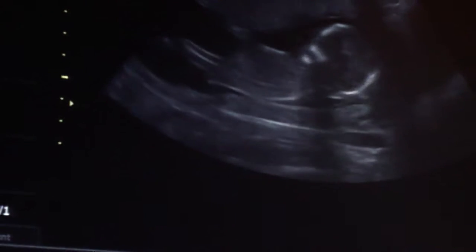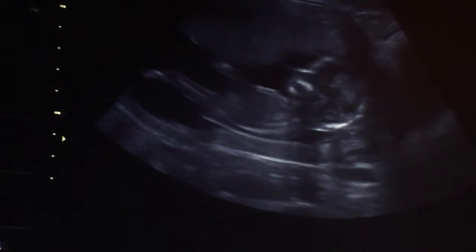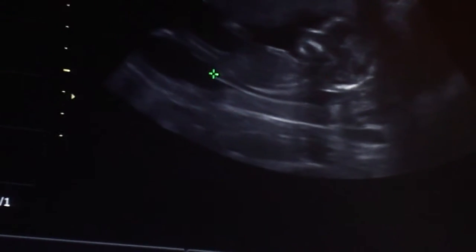So your July date — what you were thinking, July — is more accurate than the June. But I'll tell you for sure when I'm all done here.